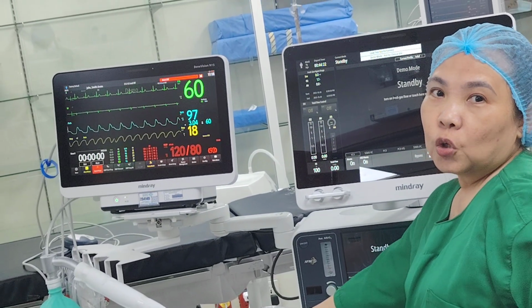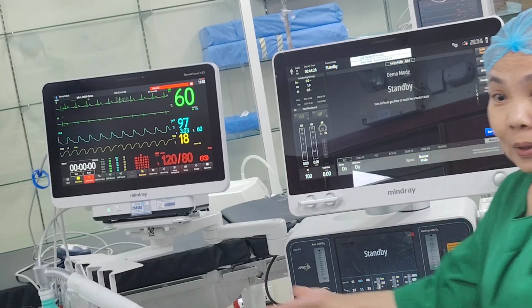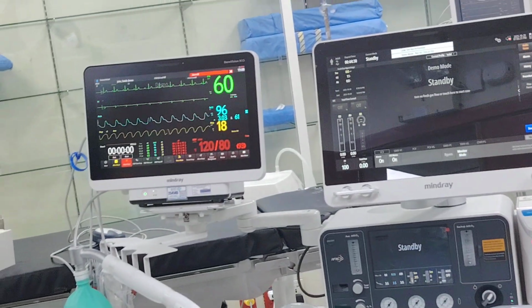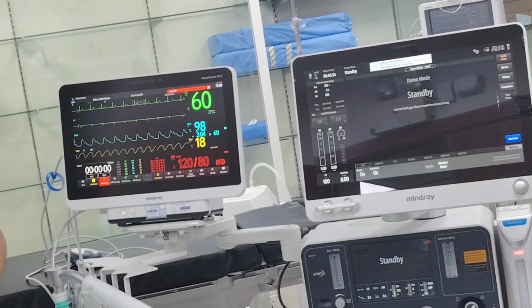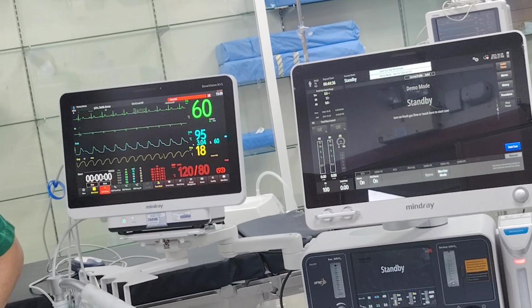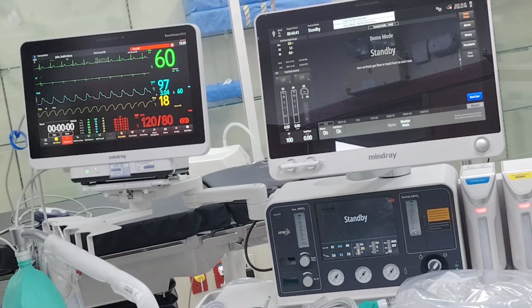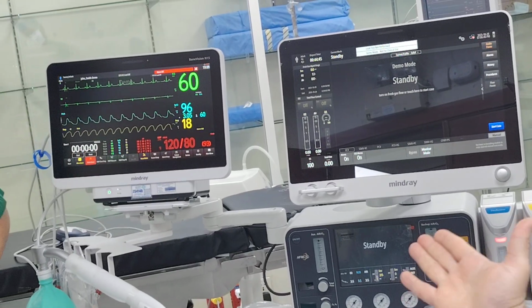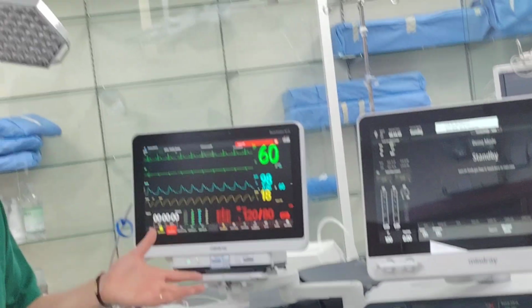You need to buy it. It is the same but small. Or give us one box. Yes, we can give you, doctor. I will ask; we have it. But you have to specify, because there is neonatal and pediatric. Neonatal is very small and comes like a plaster. For pediatric, I saw the small one, maybe from another company, but it's not compatible. I will tell you, in Mindray we have everything. You just need to request it.